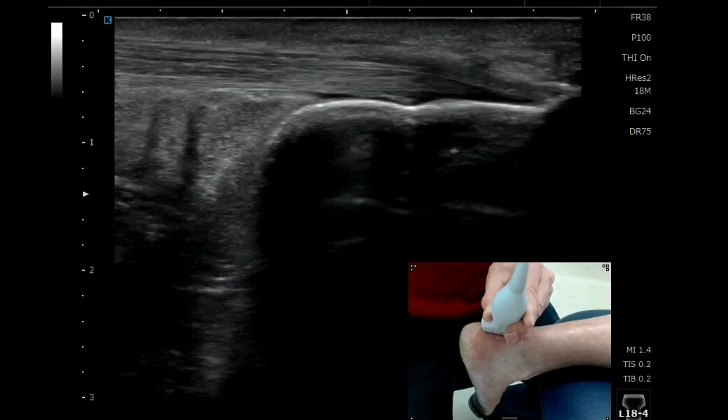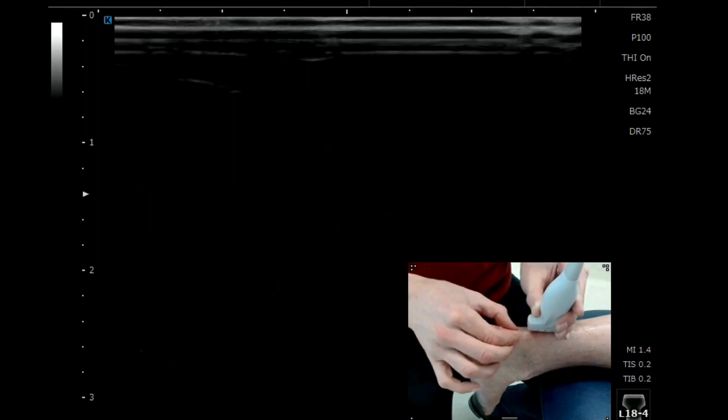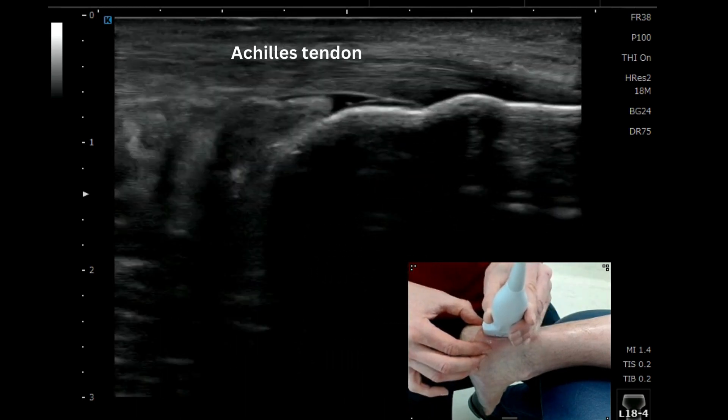When looking at the Achilles tendon, we're going to palpate the posterior aspect of the calcaneus where the Achilles tendon attaches. We'll place our probe initially in a long axis view, using our little finger to give us positional feedback as to where the tendon is.